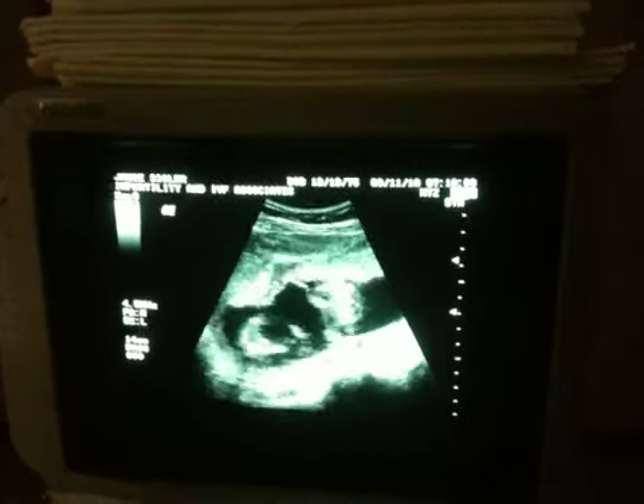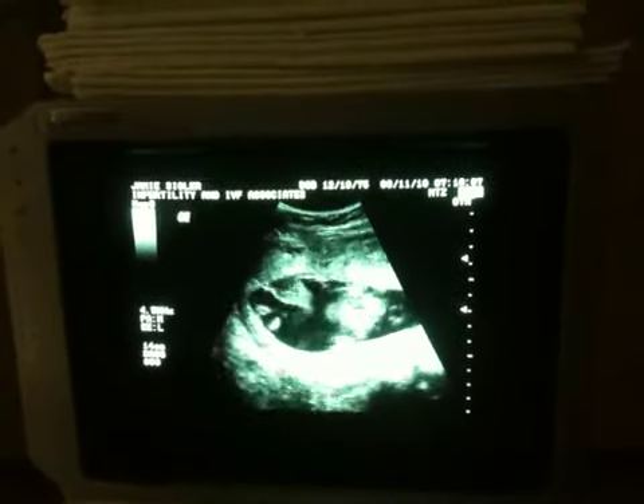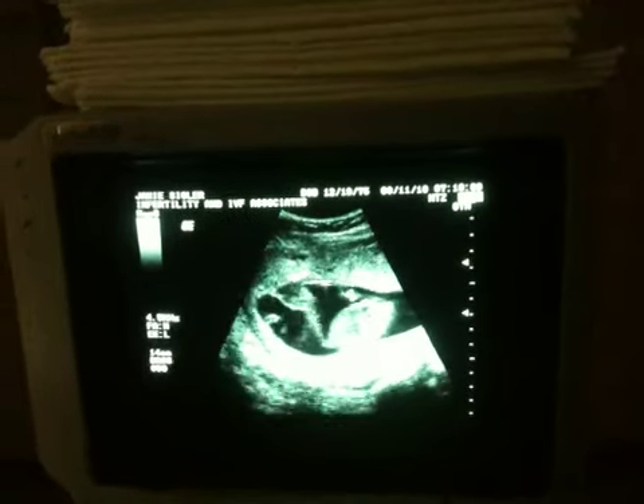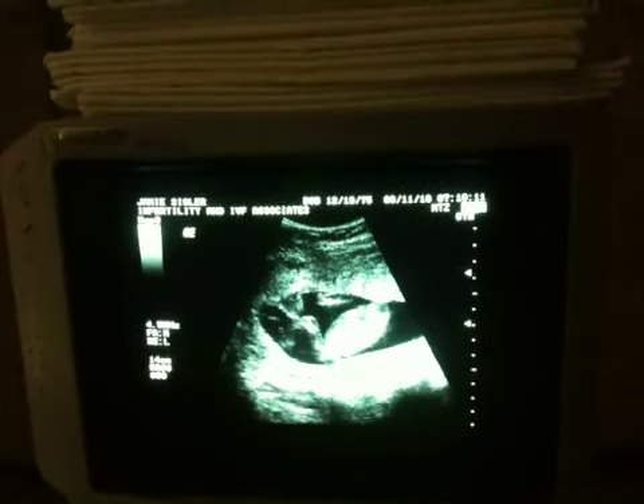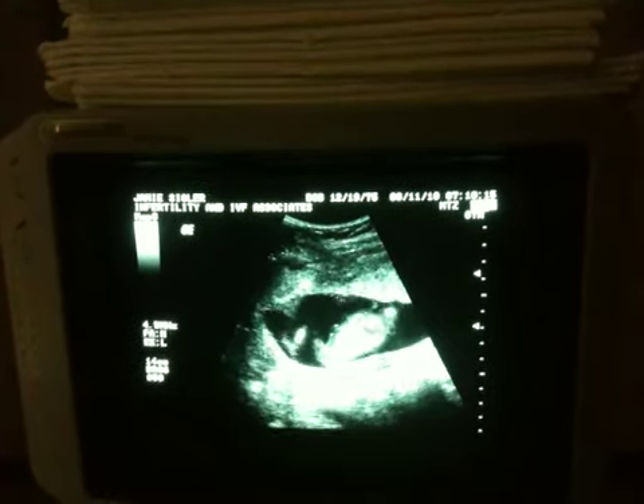Got to get a different angle here. This one's laying a little different. Oh, that's the butt there. See the legs? Oh, wow.